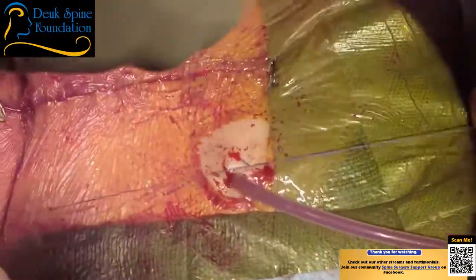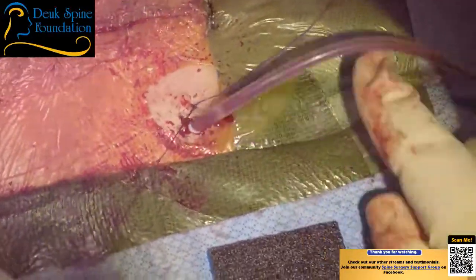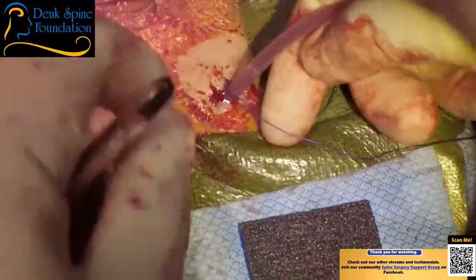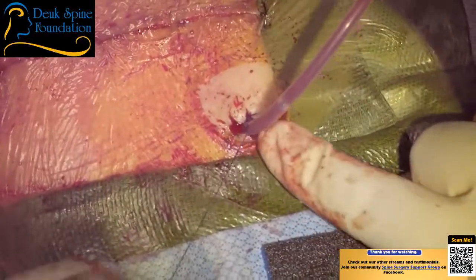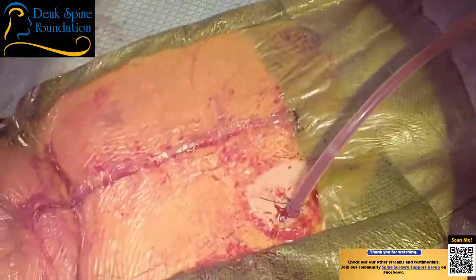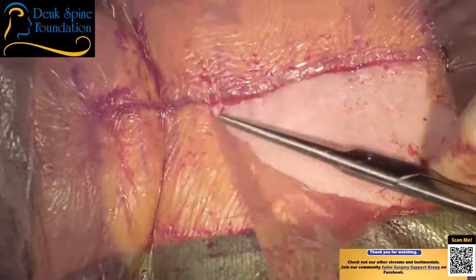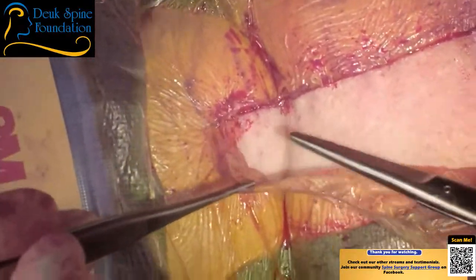How are we doing, guys? Guys, how are we doing? Okay, I need the scissor. I need the scissor as soon as you're done. Thank you. I'm going to want a wet dry, actually a stapler first.